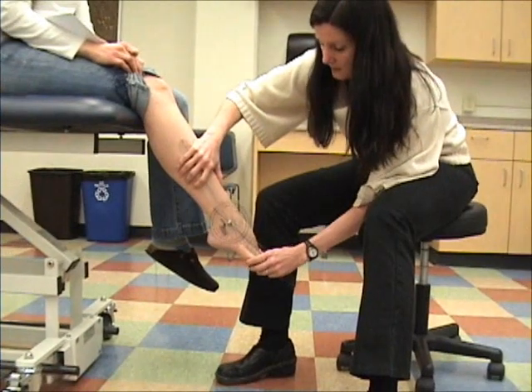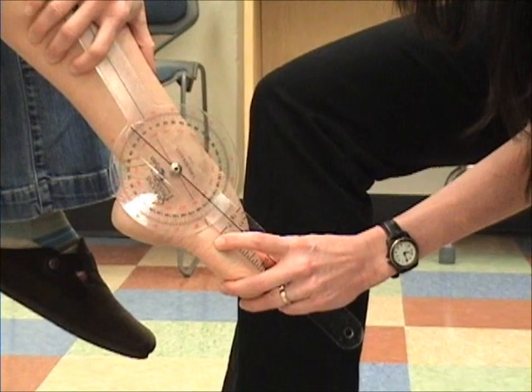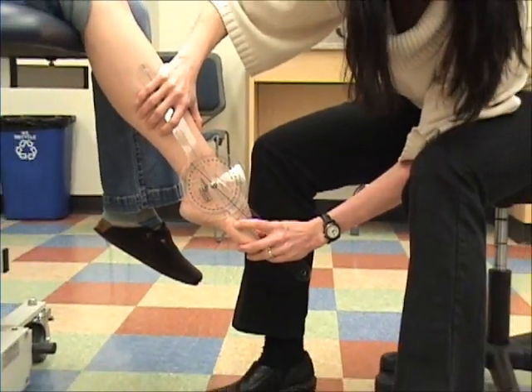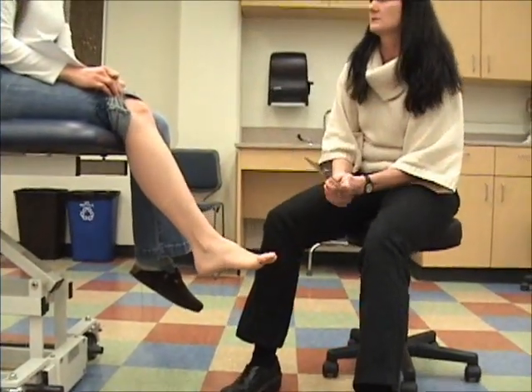I'm not really pushing it — I can probably take her a little further. She actually has more like 74 degrees once you add passive motion. Remember, your active range is going to be limited compared to your passive; your passive is going to go definitely further. So that's dorsiflexion and plantarflexion.